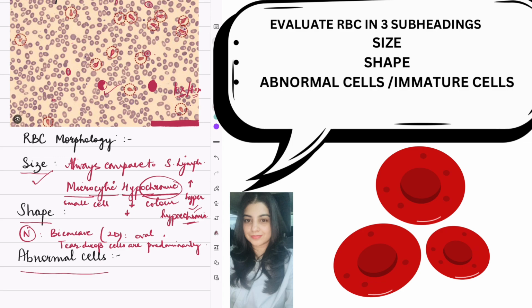Now as soon as you see teardrop cells, look for target cells. What are target cells? Target cells will look like this. There will be hemoglobin here, a pallor area, and then another rim of hemoglobin. So it's like a bullseye.